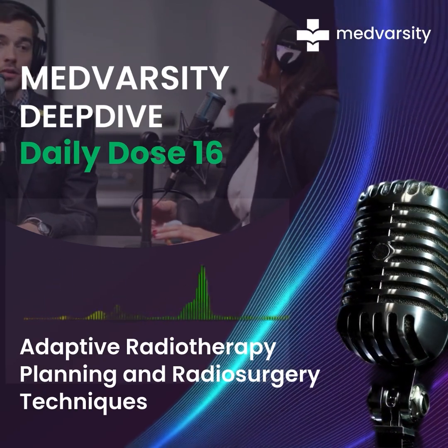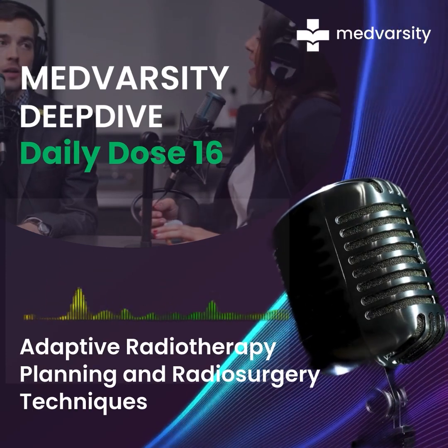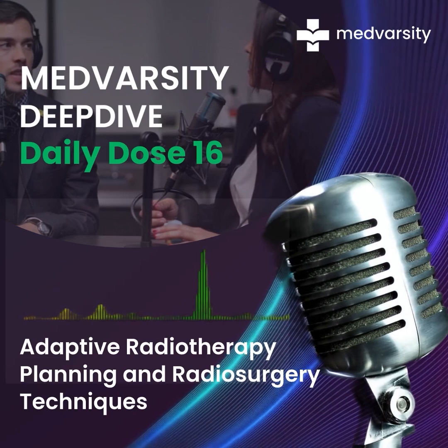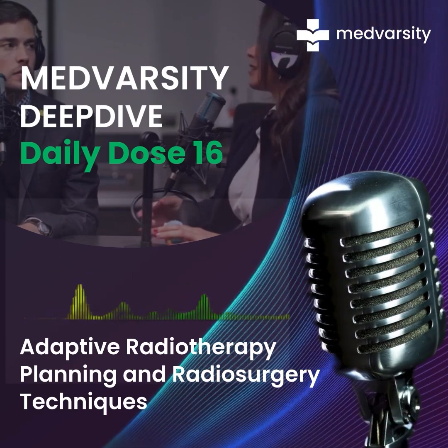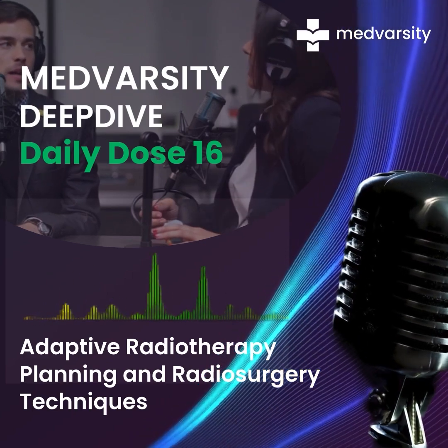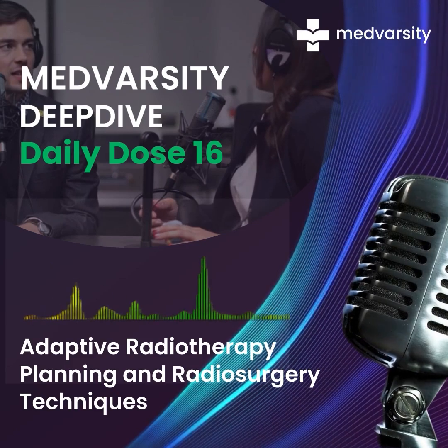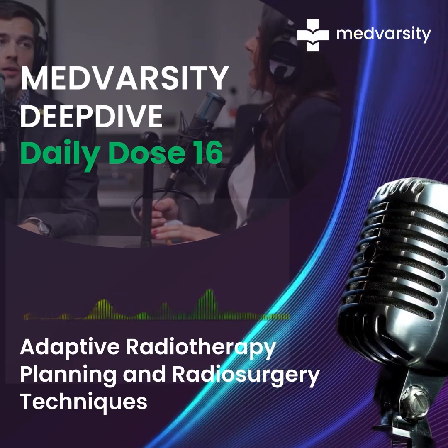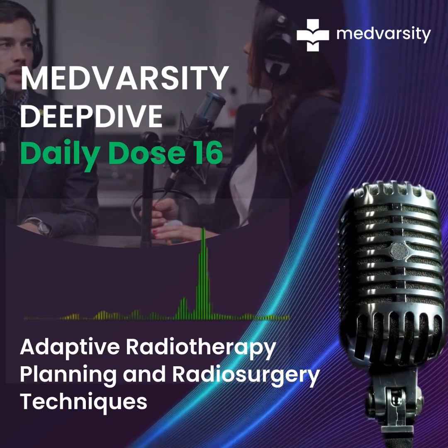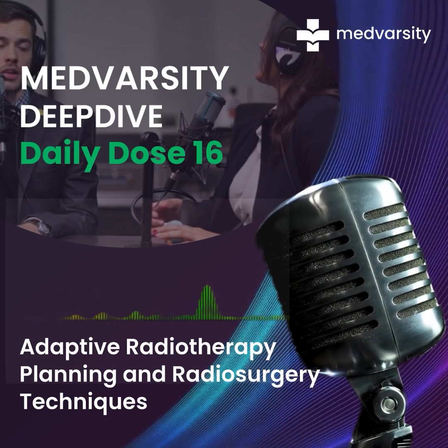It uses something called binary multi-leaf collimators, or MLCs. Okay, I'm going to need you to break that down for me because binary multi-leaf collimators sounds a little intimidating. It does sound intimidating, but it's actually a pretty simple concept. Think of it as tiny little metal fingers that can block or shape the radiation beam. In traditional radiotherapy, those fingers move together like a sliding door. But in helical tomotherapy, each finger can actually move independently. Oh, wow. So they can open and close at any point during that spiral rotation. It's like having thousands of tiny shutters all working together to shape the radiation. That's a really great way to put it.